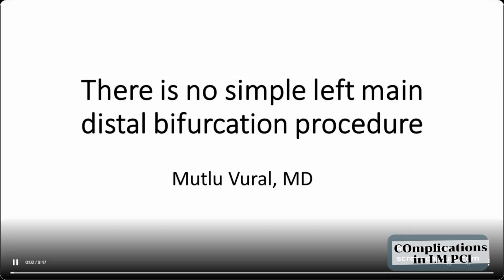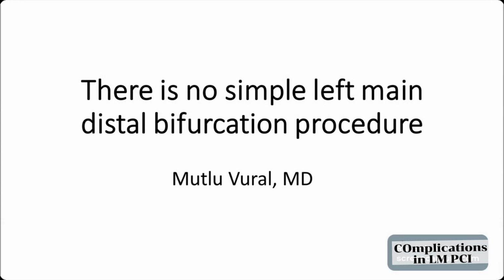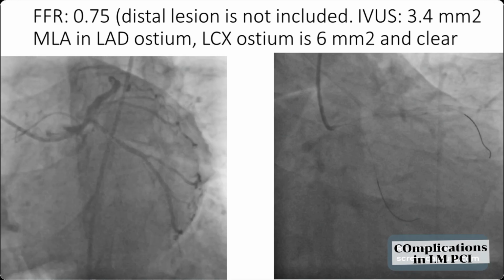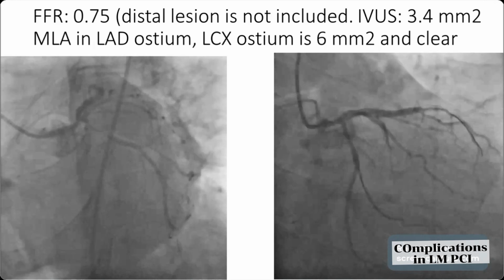This is Mutlu from Istanbul. My title is "There is no simple left main distal bifurcation procedure." I will present two short cases. This is the first case.